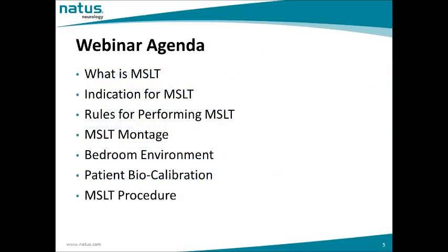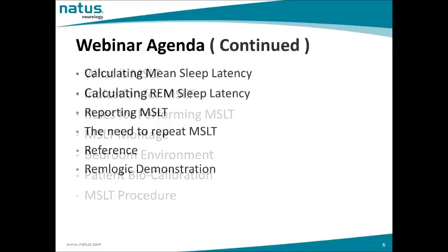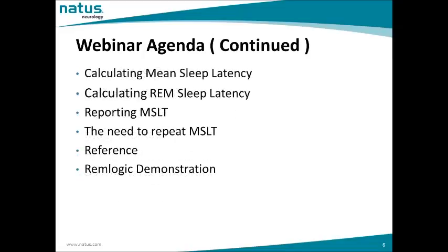Okay, let's go through the agenda today. I will be going through what is MSLT, the indication for MSLT, rules for performing MSLT, the MSLT montage, the bedroom environment for MSLT patient, the patient biocalibration, MSLT procedure, calculating mean sleep latency, calculating REM sleep latency, reporting MSLT, the need to repeat MSLT, the reference, and of course, last but not least, the RemLogic demonstration.